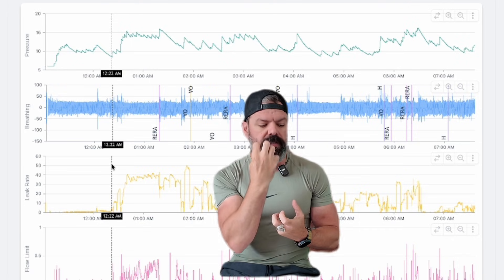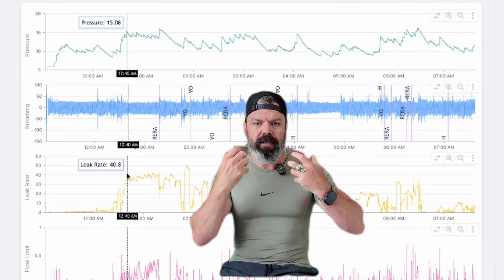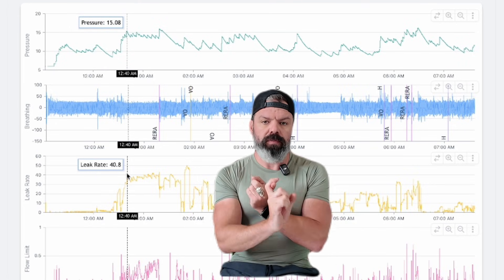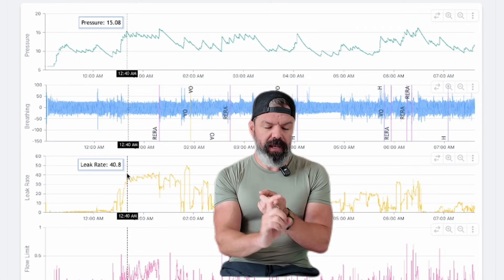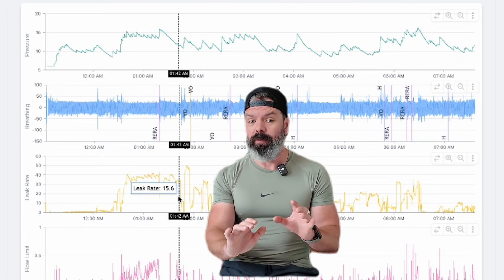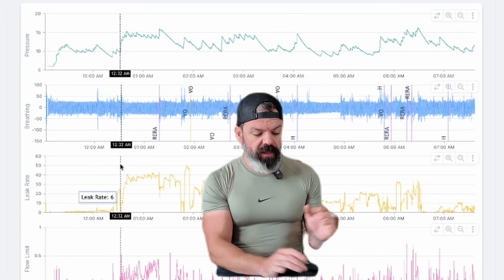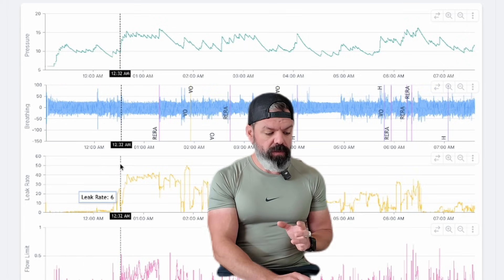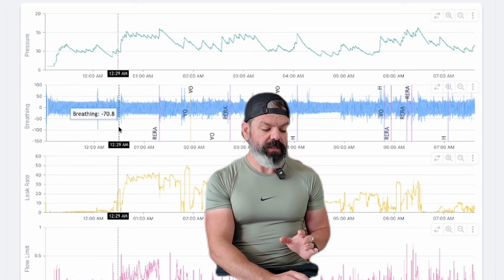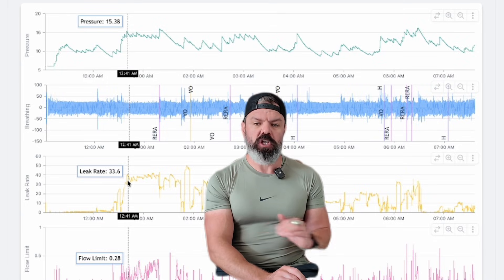Once we get 40 to 50 liters per minute of leak, everything goes to shit. The automatic algorithm cannot titrate correctly — it can't work out the breathing, can't work out the apnea flags. It's gone once it hits 24 liters. But more importantly, everything else is screwed as well. The whole system is completely broken once leak increases. And that's why fixed pressure is so much better.